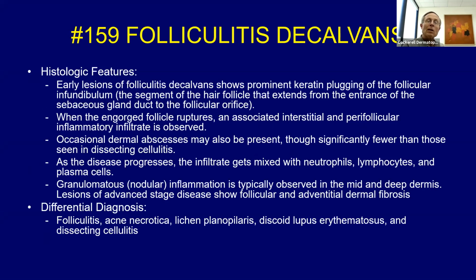Now, lichen planopilaris clinically can sometimes look alike. And sometimes you get a bad case of lichen planopilaris where you get the perifollicular lymphocytic infiltrate, destroys the follicle, ruptures, and you get a secondary suppurative folliculitis. So you can get a secondary neutrophilic influx in lichen planopilaris on occasion.